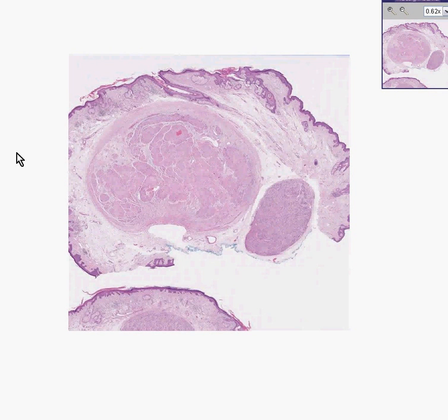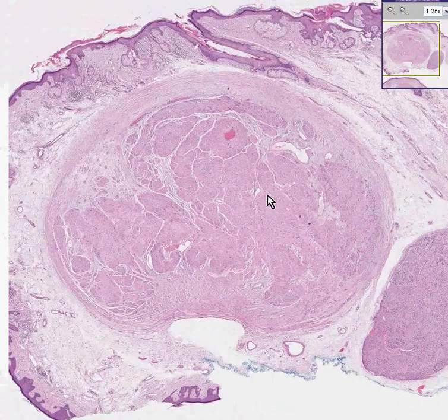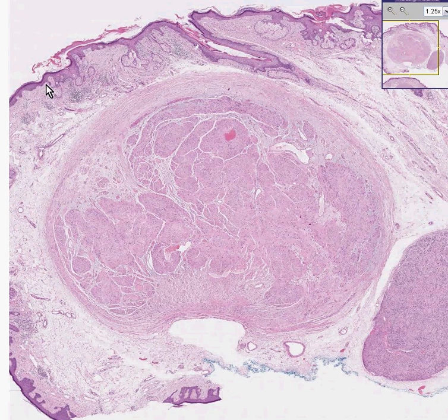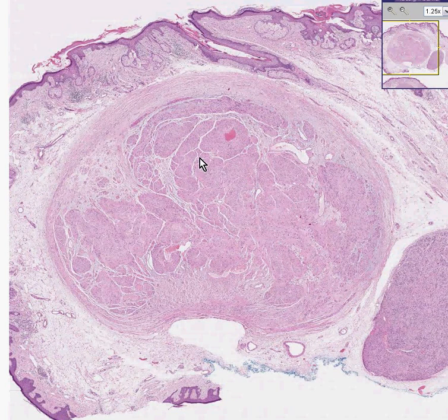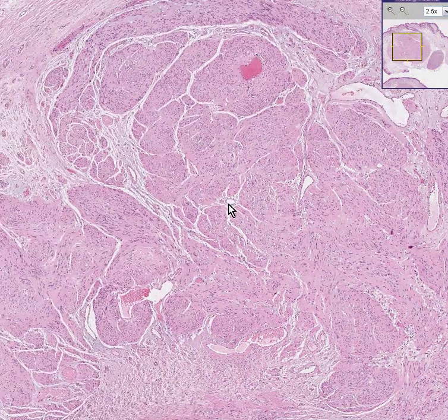Here is another skin tumor, primary to the skin. Notice once again the overlying epidermis looks pretty normal, looks pretty intact. Notice instantly that the tumor in question does not involve in any way the epidermis, but this connective tissue of the dermis. And notice also that the tumor does not look epithelial — it looks spindly or perhaps of connective tissue origin.